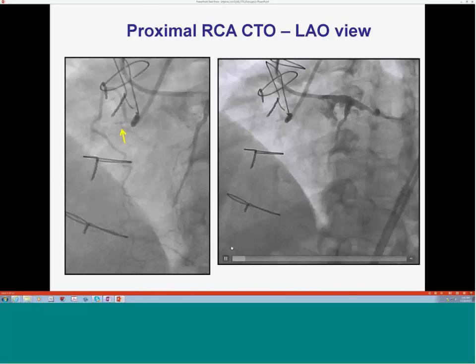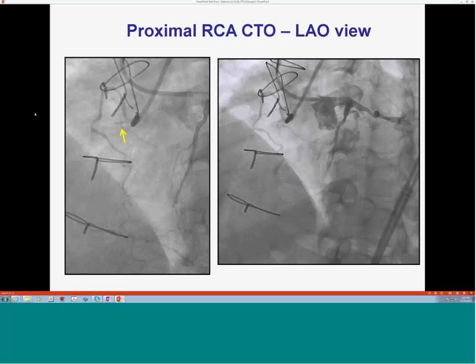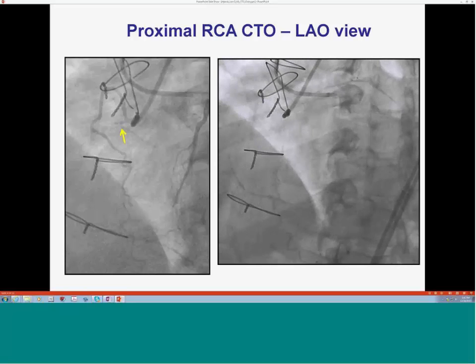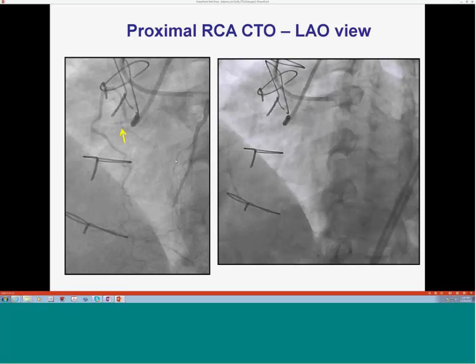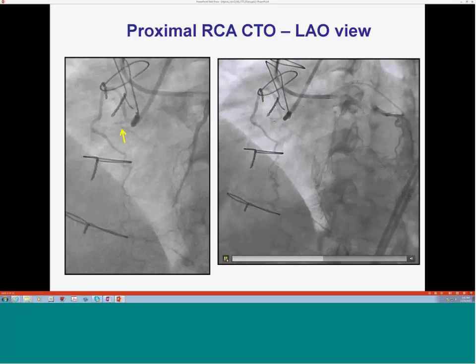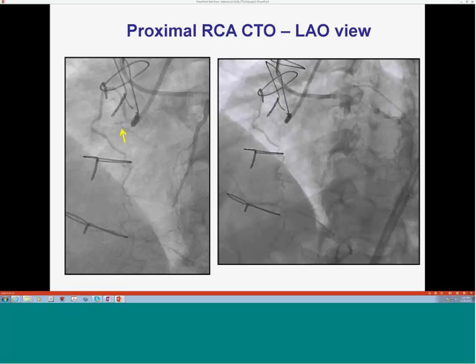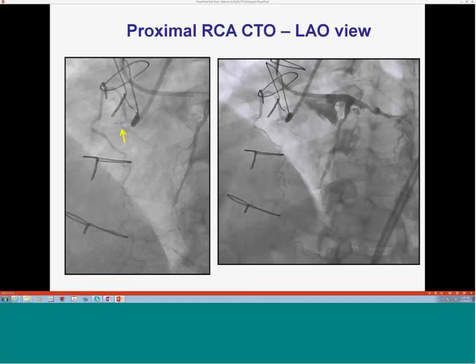So, any thoughts about this? Go primary retrograde or primary antegrade? It's a little hard to see, Manos. But it looks like there may be a little nipple after that right ventricular or right atrial branch comes off, which may represent a continuation of the RCA. So it may be worthwhile to try the antegrade approach first. But it's a little hard to tell based on looking at these pictures.